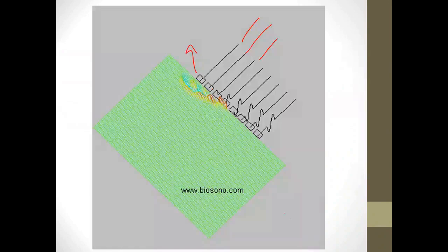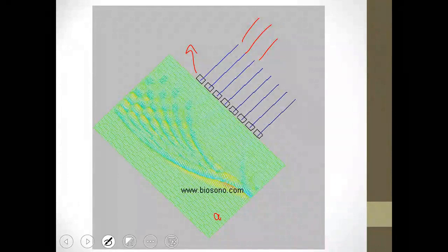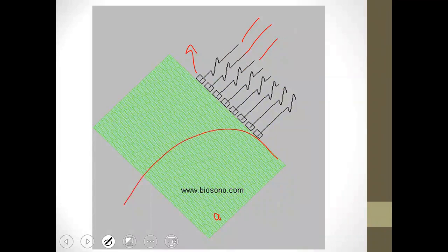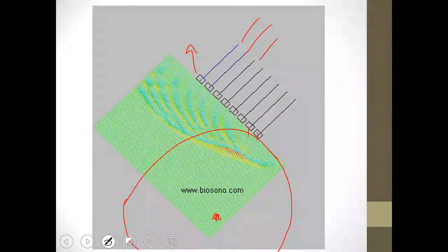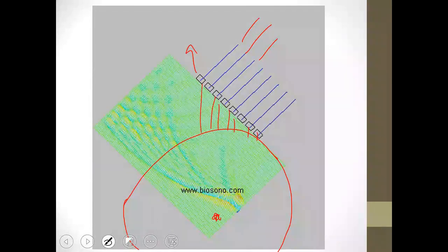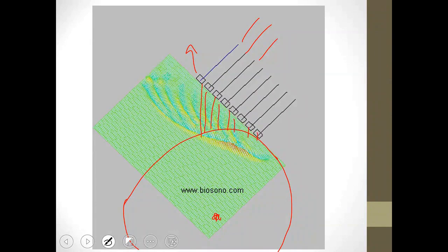How does this happen? This occurs because you want to set your focus point in this area, so you create a delay. You take the semicircle we were talking about, so here is the semicircle, or here is the circle, I apologize, and here is your circle. This distance is this, and this distance is that, and this distance is this, and so on. This distance calculates the delay time that we are all talking about.